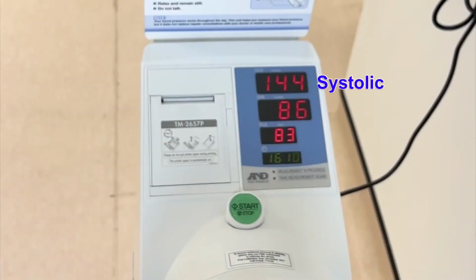The top number, called systolic, is when the heart is beating, and is always higher. The second number is when the heart is relaxing, called diastolic. The third number is your heart rate, which can also go up when you are excited or stressed.